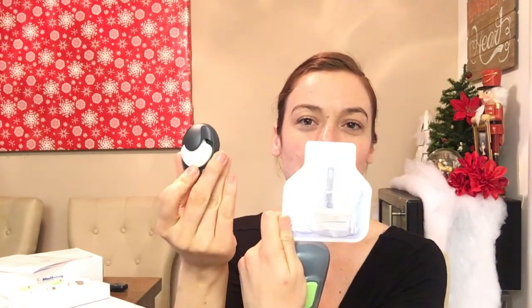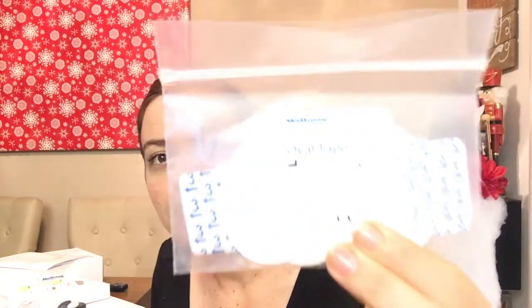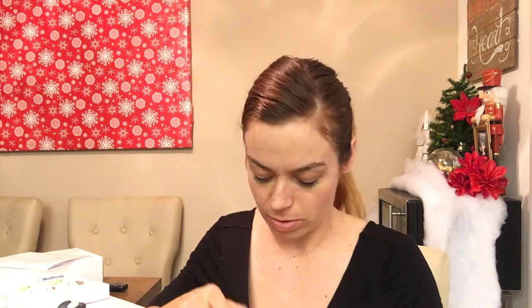So what I have is a one-press inserter where I'm gonna go ahead and insert the sensor. I put the sensor onto this part and attach it to my body. I also have the tape, which is what's basically going to keep it adhered to my body. I already cleaned my stomach — I ran out of wipes so I just went with warm soap and water and wiped it down. I need to go buy some alcohol wipes.